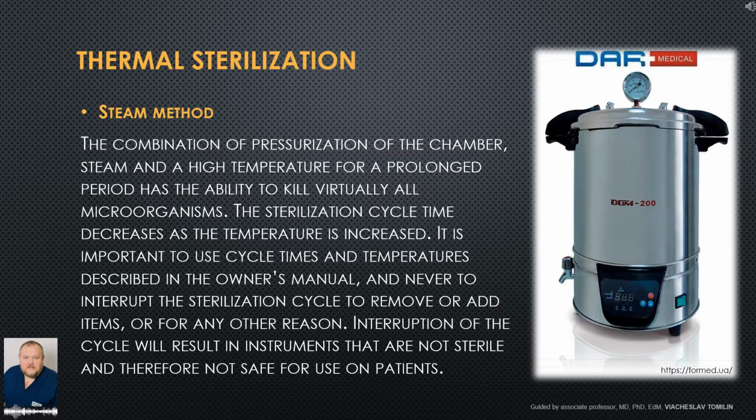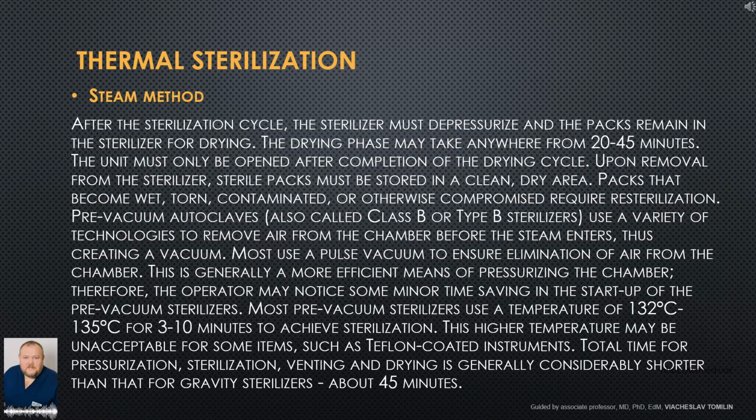The sterilization cycle time decreases as the temperature is increased. It is important to use cycle times and temperatures described in the owner's manual, and never to interrupt the sterilization cycle to remove or add items, or for any other reason. Interruption of the cycle will result in instruments that are not sterile and therefore not safe for use on patients.